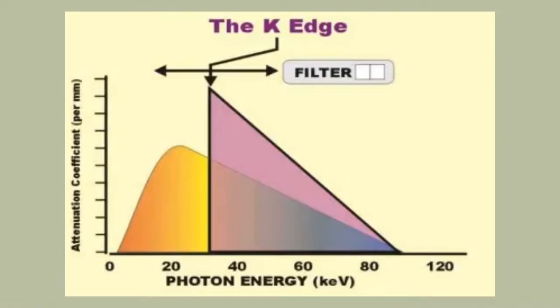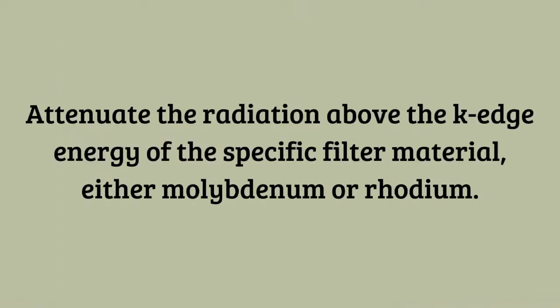Target and filter combination. The filters used in mammography are based on the K-edge principle and attenuate the radiation above the K-edge energy of the specific filter material, either molybdenum or rhodium.